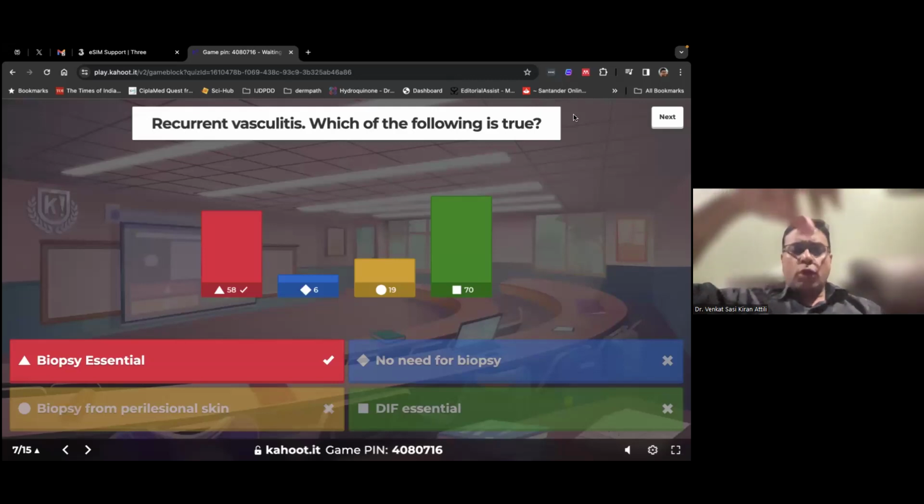You see the ulcer on top. Often the entire epidermis is not ulcerated. You see a bit of normal skin, which is still preserved. And if you see vasculitis underneath that bit as well, then you know that the vasculitis is primary and not secondary to the inflammation caused by the ulcer.